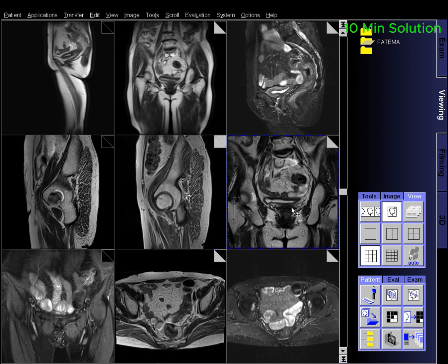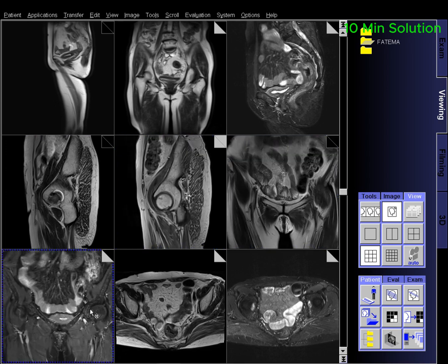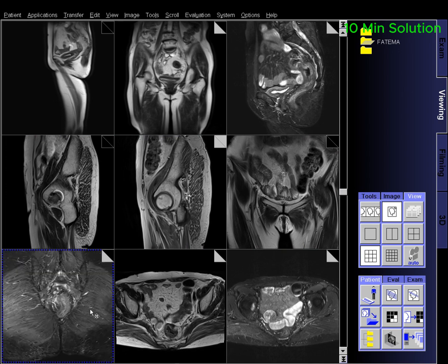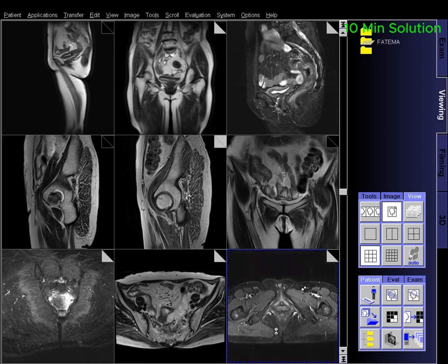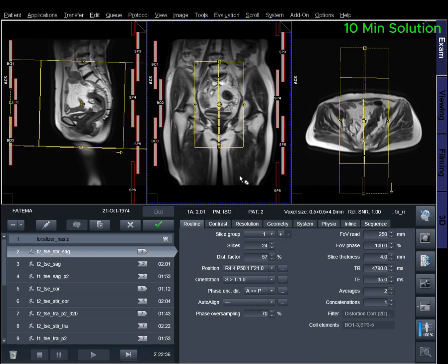Today we will learn how to perform MRI of the CA Pelvis, also known as Cervical Cancer MRI. This MRI is an essential imaging procedure for determining the exact stage and local spread of cervical cancer. Let's begin with patient preparation. The urinary bladder should be moderately filled, and the rectum should be empty. This helps produce clear images and better visualization of pelvic anatomy.